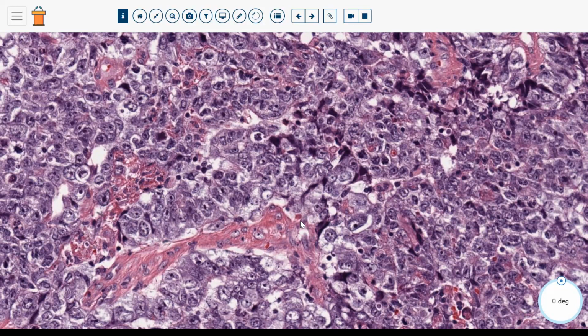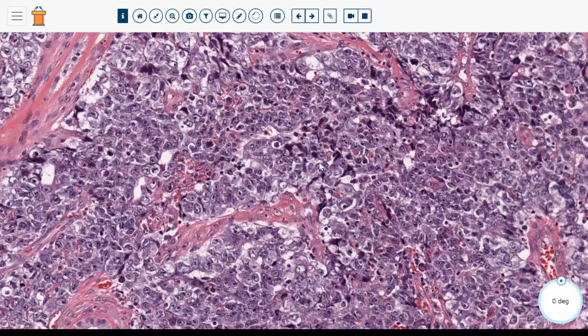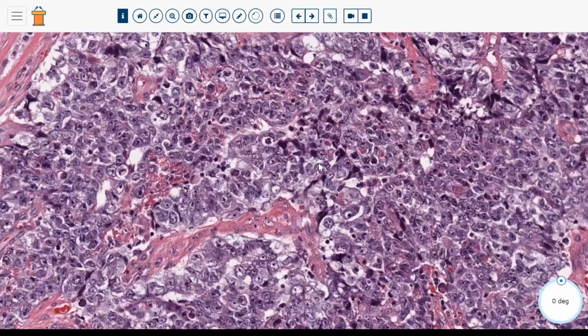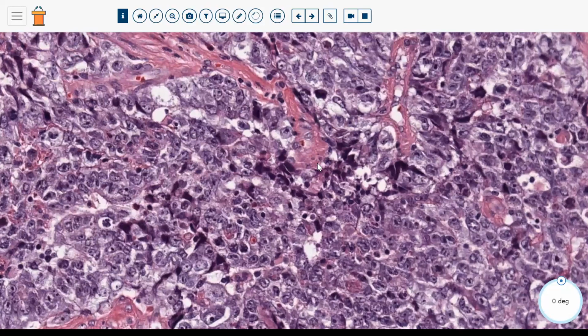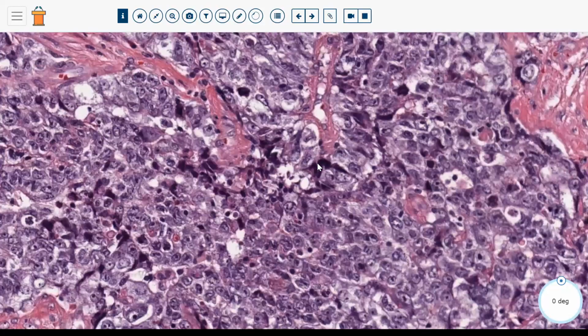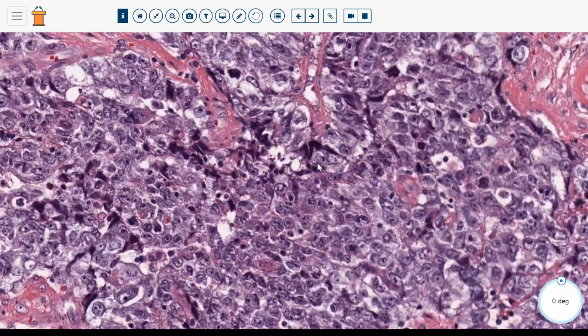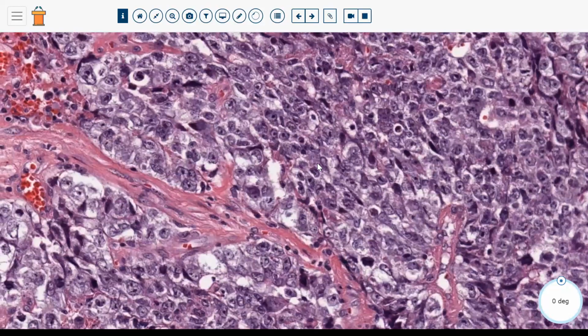And the only importance of that is just to realize that that's something that happens in embryonal carcinoma, and not to let it fool you into thinking that this is the biphasic pattern of a choriocarcinoma. So these are not necessarily the trophoblastic cells of a choriocarcinoma. And again, if you have that differential diagnosis, OCT3/4 would be very helpful, as immunohistochemistry for OCT3/4 will be classically positive in essentially every cell of embryonal carcinoma, whereas it is usually not positive in the cells of choriocarcinoma.